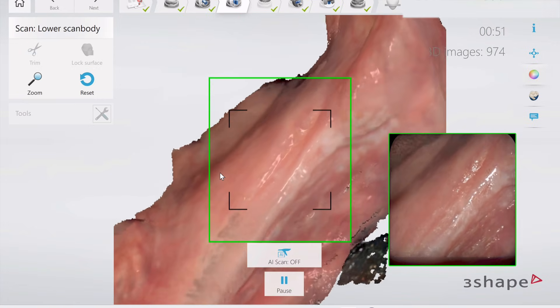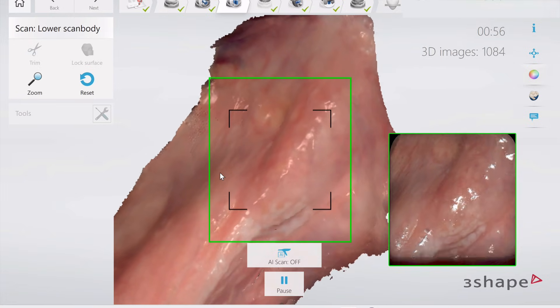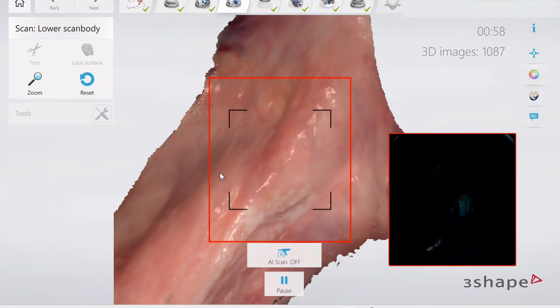And so if you're training your team, they need to have the proper tools to be able to do these scans. And look, we're even able to go back to the retromylohyoid fossa and re-pick that up. It is insane.